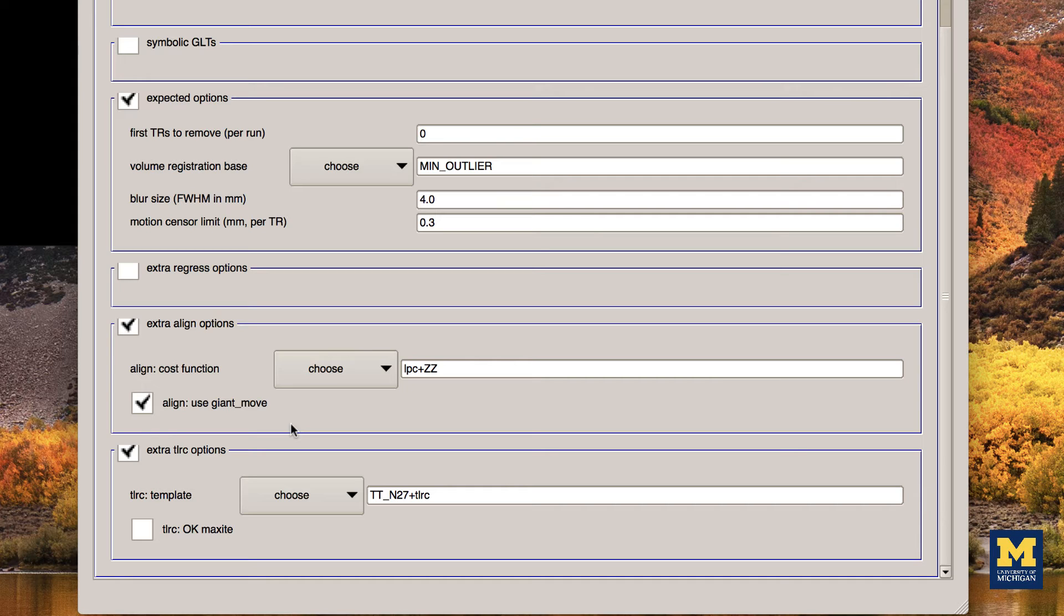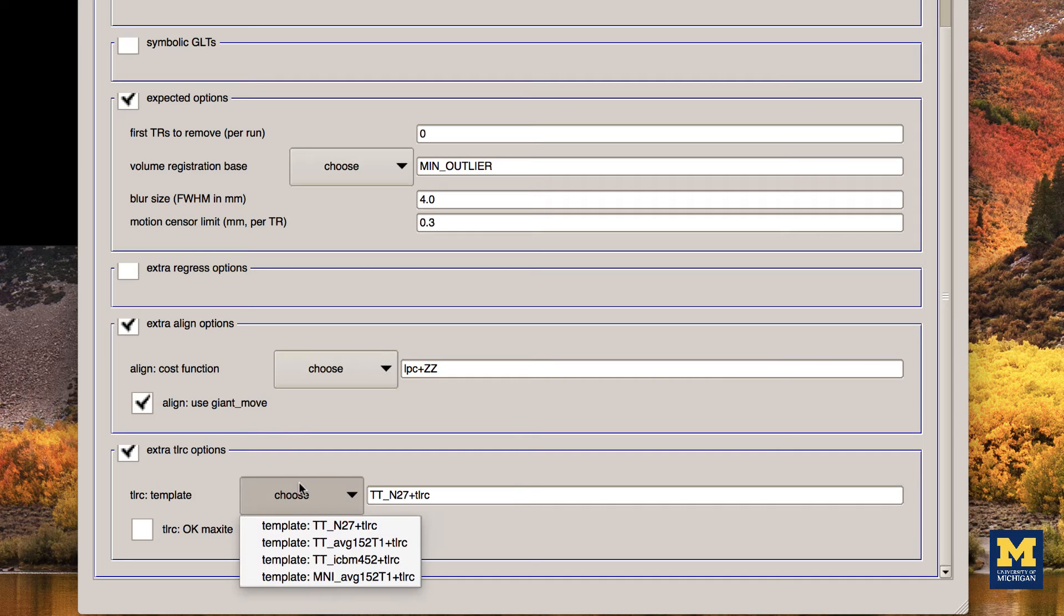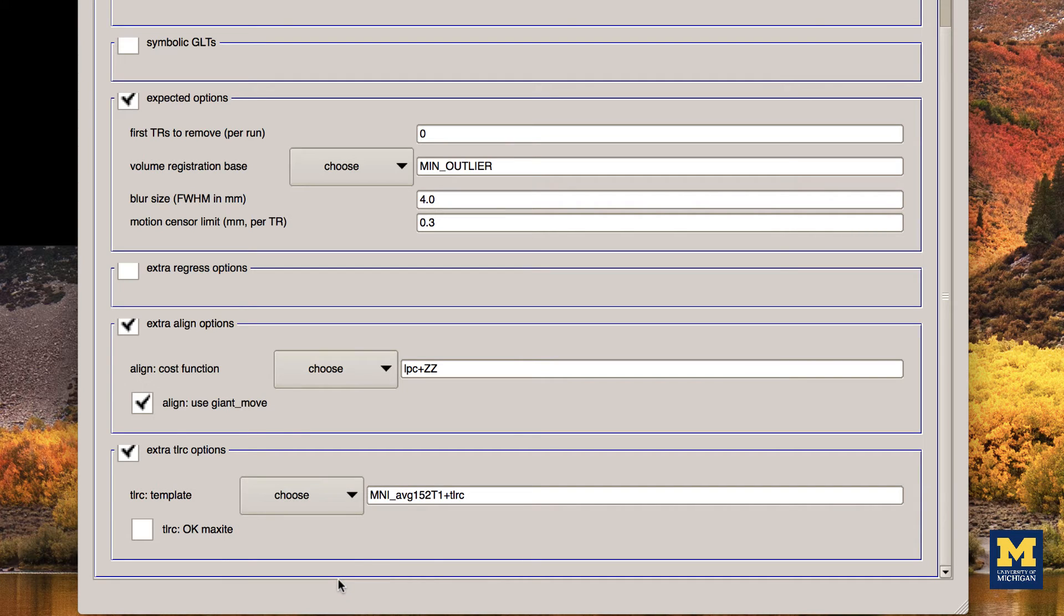Lastly, in the Extra TLRC Options field, choose the template MNI AVG152T1, since MNI templates are becoming the most commonly used templates in the field.